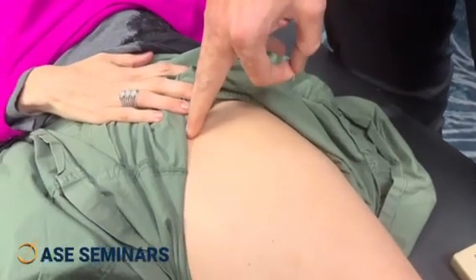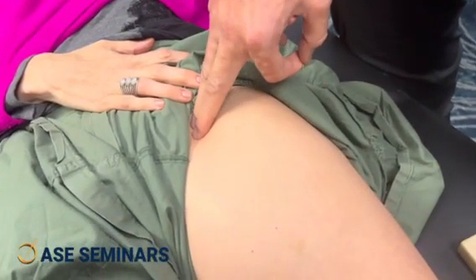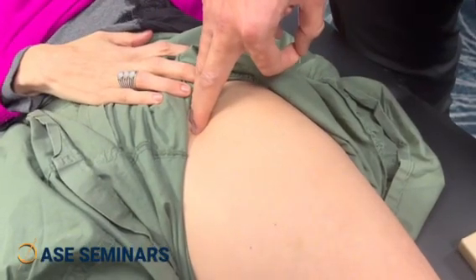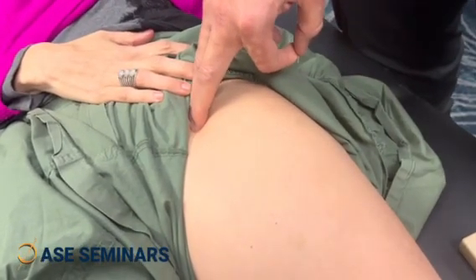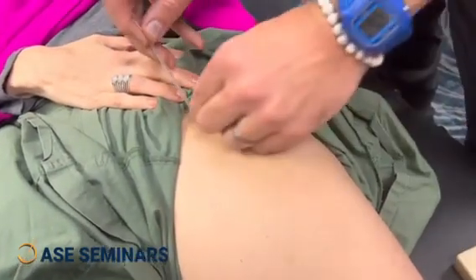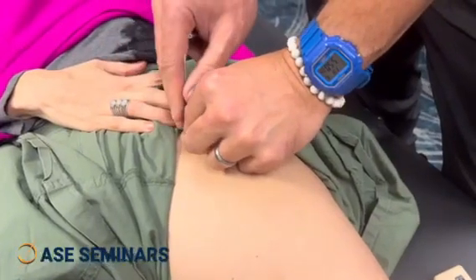We find the femoral pulse right there because it goes vein, artery, nerve — the VAN mnemonic. I'm on the artery, so I go just lateral to that, and that's the nerve. I'm not going to insert deeply.